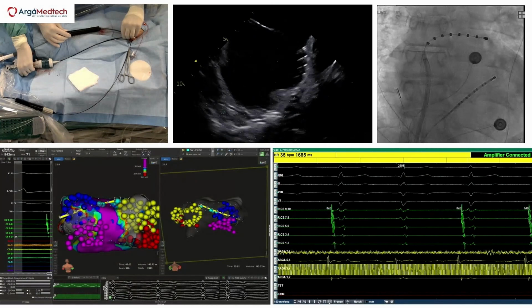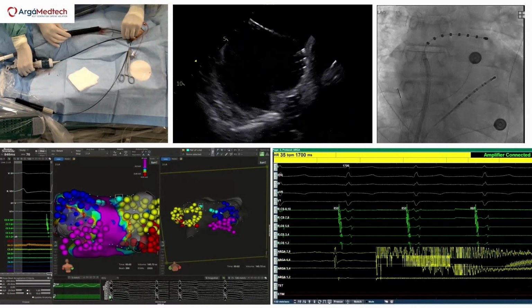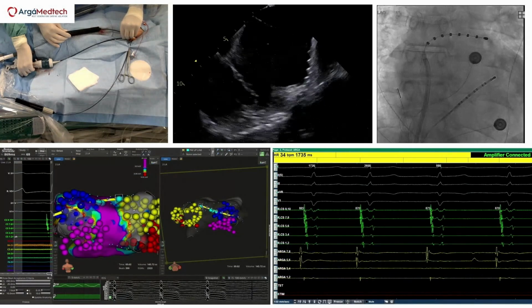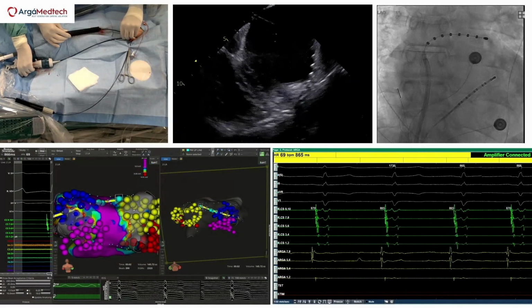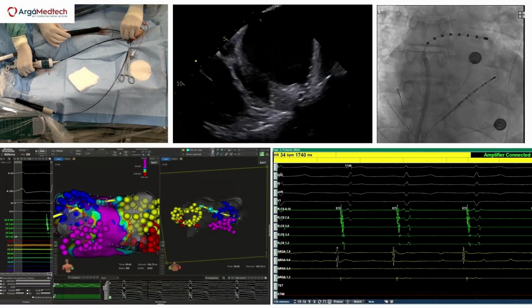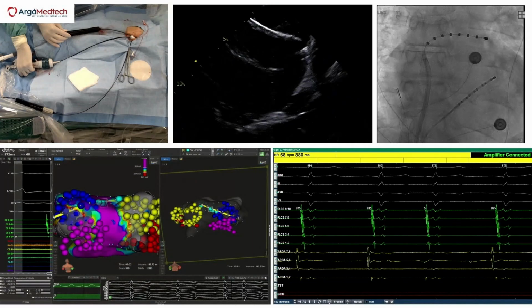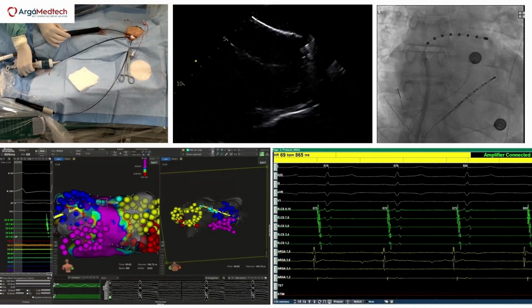So in this way, we are using the distal part of the catheter as an anchor. So 1, 2, let's say here, 1, 2, 3, 4, I use them as an anchor. You see? And you turn on the other 4. Yes, so 1, 2, 3, 4 is turned off. It's deep inside the vein. We don't need ablation there. Okay. And what we're going to do now is configure just to deliver from 5, 6, 7, 8, and we're going to do the max. Max lesion is going to take a while, closer to 24, 25 seconds.